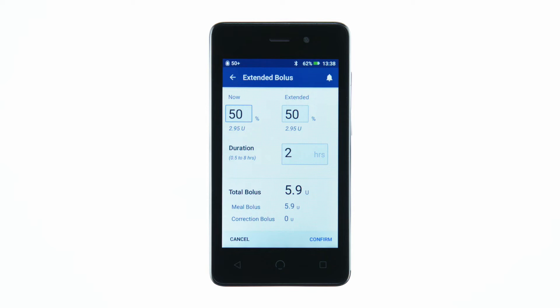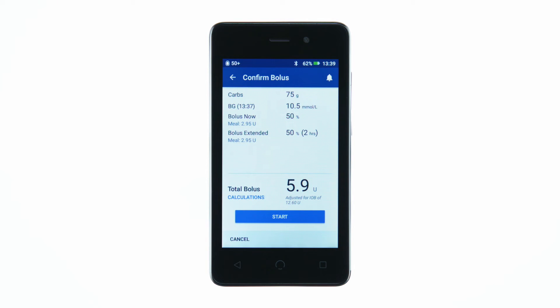Tap Confirm. Review the bolus details, then tap Start to deliver the bolus.